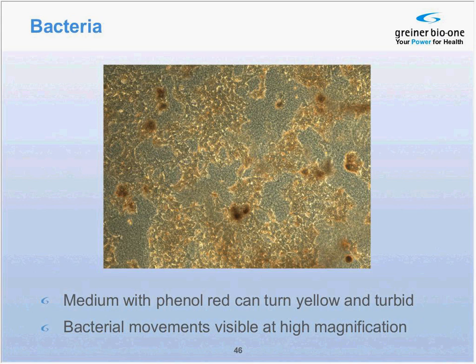Most likely the source is bacterial contamination due to improper aseptic technique in the cell culture lab. Many bacteria can be recognized fairly easily by the massive propagation and their movement that is visible at high magnification in the microscope. Their propagation exhausts most of the nutrients in the medium. The diagnosis can be assured by plating the medium on LB agar plates, followed by a microbiological examination.